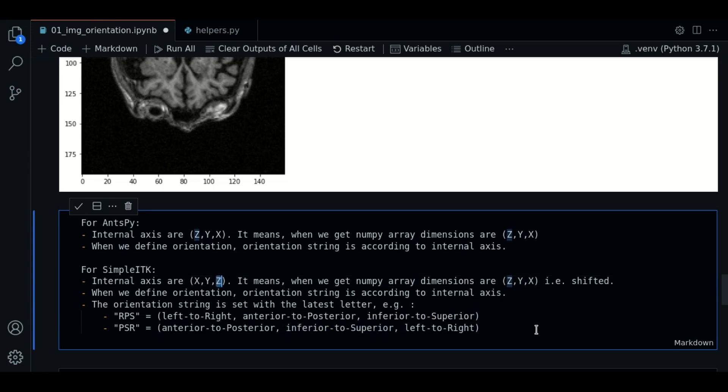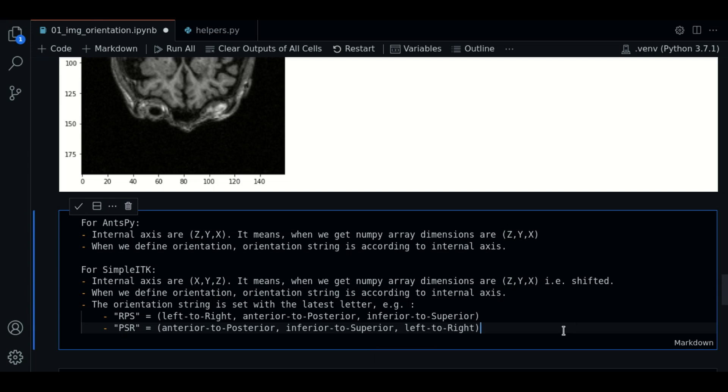If we use, for example, PSR, the same goes on. So, keep in mind and come back to this info whenever you want to understand how to set the orientation with SITK.